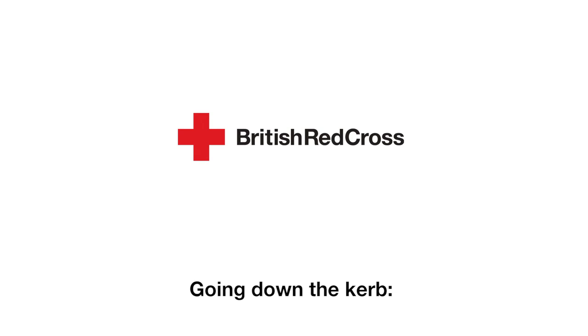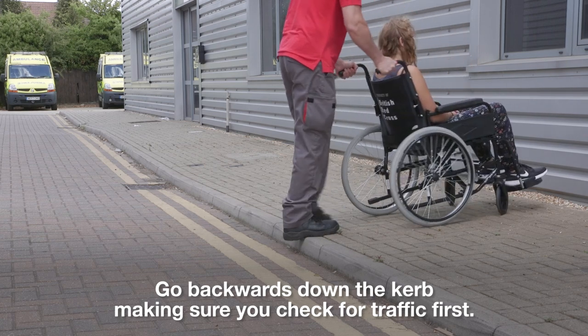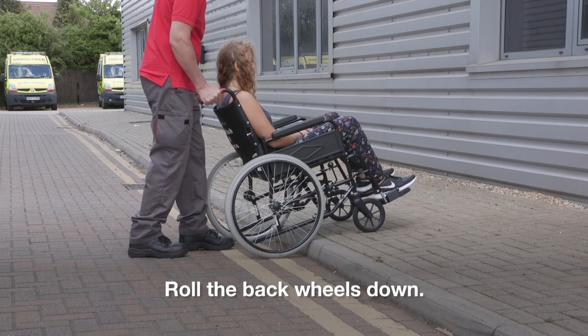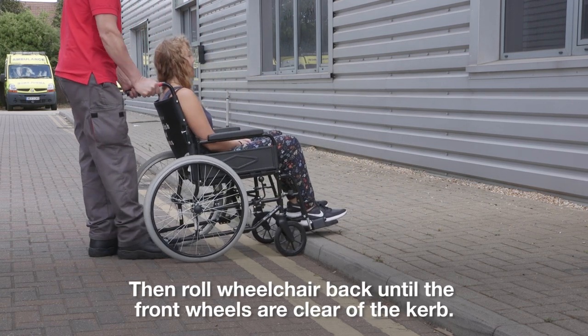Going down the kerb: Go backwards down the kerb, making sure you check for traffic first. Tell the person in the wheelchair that you are going down the kerb. Roll the back wheels down, then roll the wheelchair back until the front wheels are clear of the kerb.